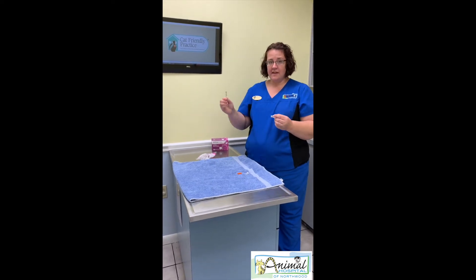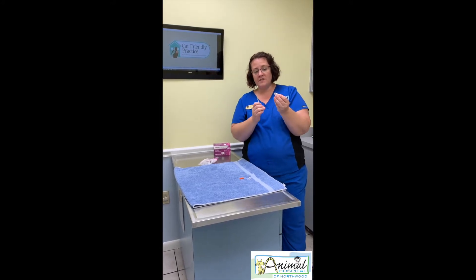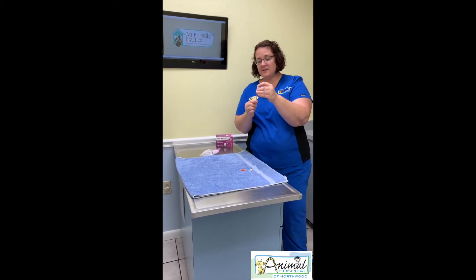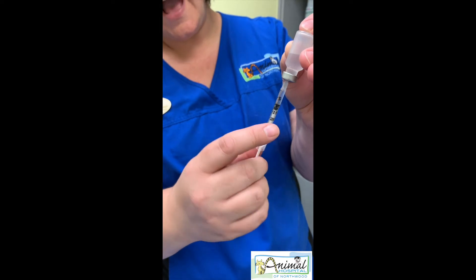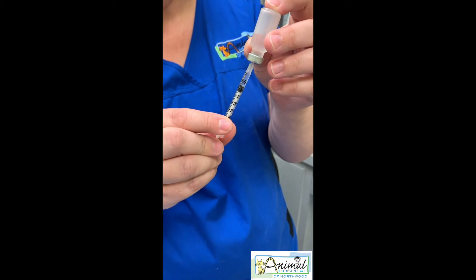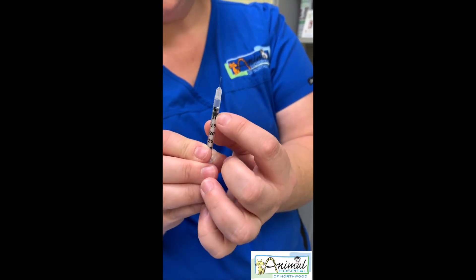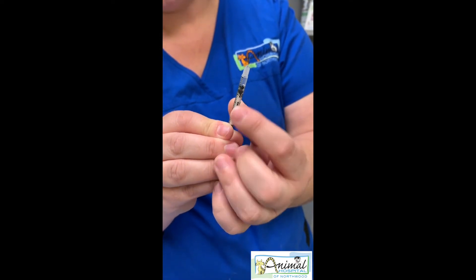You don't want to set the needle down or touch anything — keep it in your hand the whole time. Get your bottle and hold it with the stopper upside down, then insert your needle into the bottle. You want to be able to see the markings on the syringe. I'm going to go past my marking — so if this cat needs five units, I'll go past the five and then pull back to the top of my black plunger before removing the bottle. We're looking at the very top of the plunger, which should be right on that number five line.